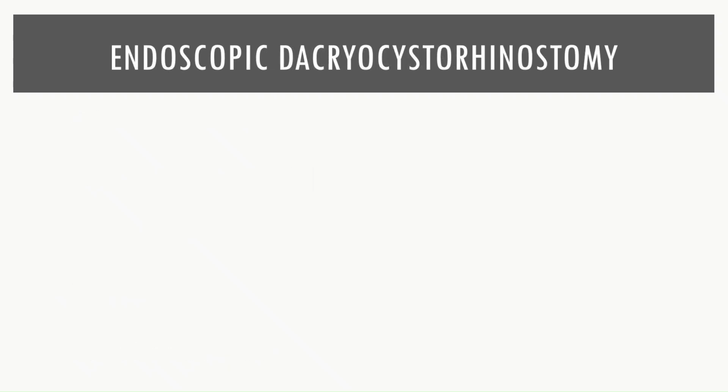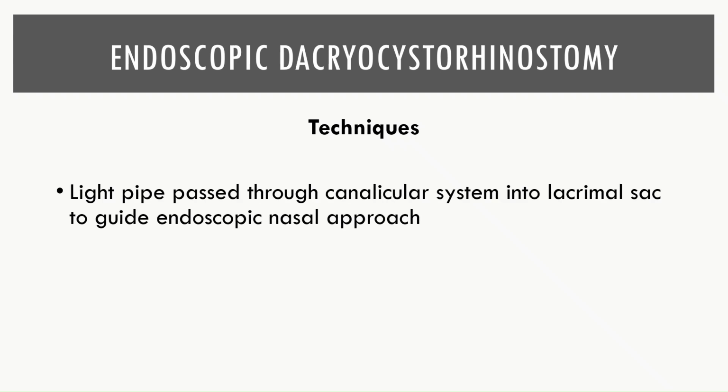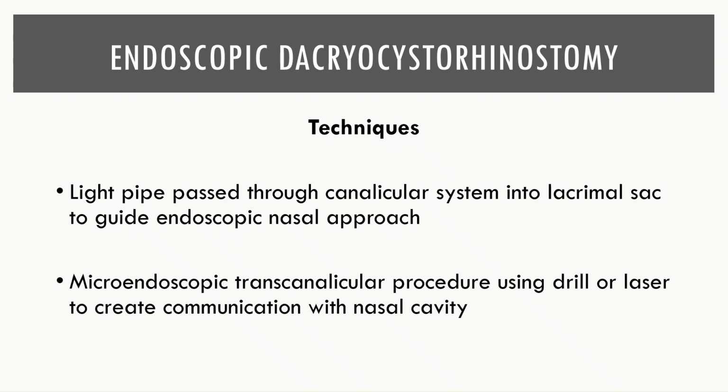Endoscopic Dacryocystorhinostomy. Endoscopic DCR encompasses several techniques. A light pipe can be passed through the canalicular system into the lacrimal sac to guide an endoscopic approach from within the nose, or a microendoscopic transcanalicular procedure can be performed using a drill or laser to establish communication with the nasal cavity.